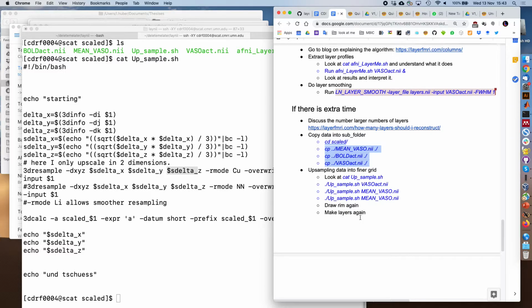Also, Valentin Kemper suggested to upsample k-space and do it in k-space. Then there are even fewer assumptions with respect to the interpolation. So just zero pad in k-space, and then do your FFT, because a boxcar Fourier transforms to a sinc. So zero padding is like sinc interpolation? Yeah, kind of, assuming that we have no phase in the image.